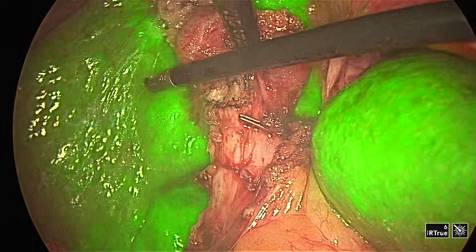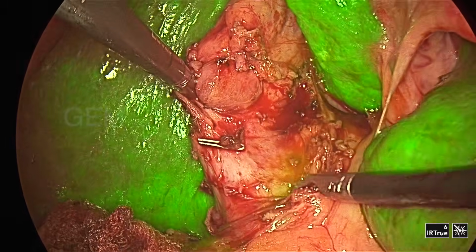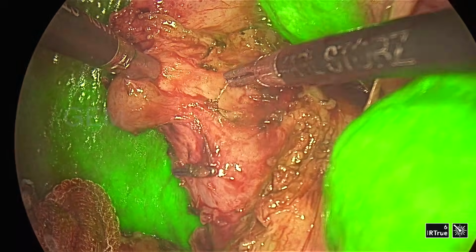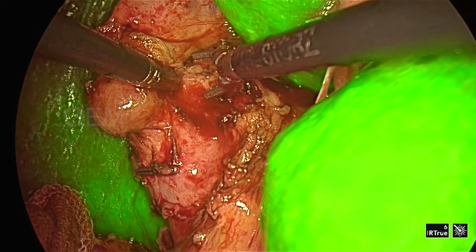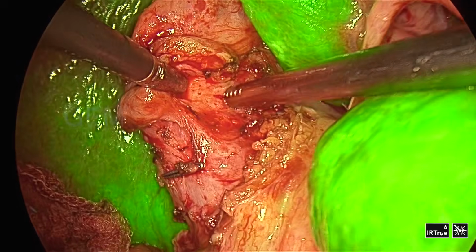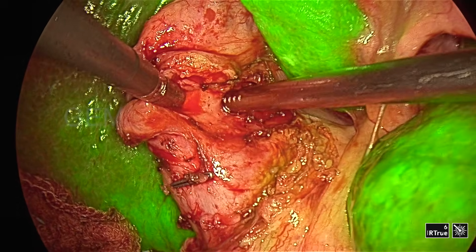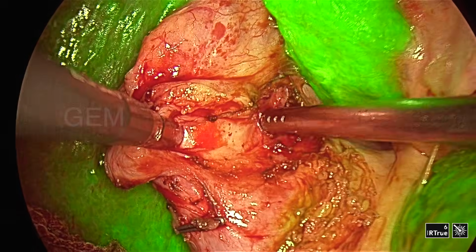So it is a chronic case, a treated case, so I am not able to... I thought, no, I have to divide this infundibulocystic duct junction. Then I can trace the cystic duct till the lower end of the CBD. So that is my plan. Otherwise it is very difficult. No, it is very hard.